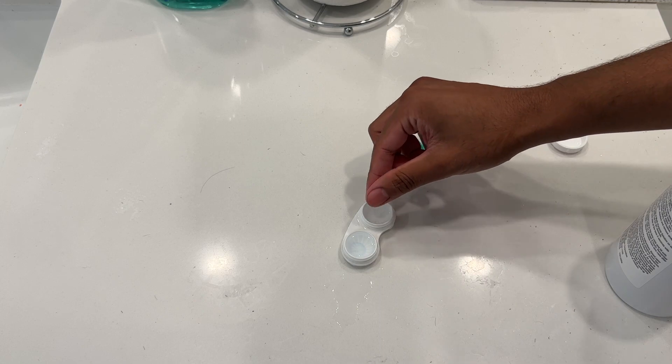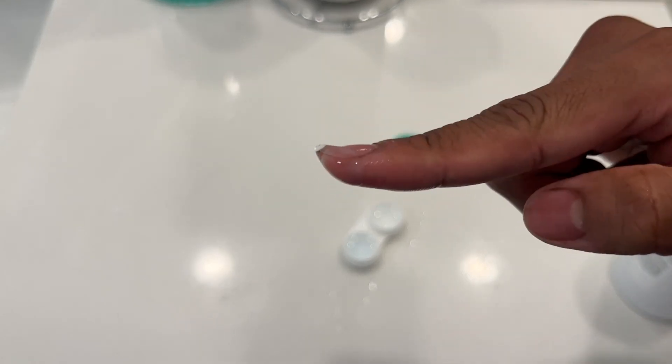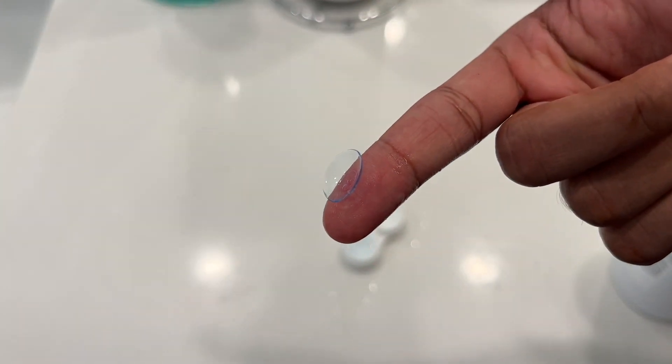Overall, I have been super satisfied. I've been using this for the past three years with all of my contacts. This one is able to disinfect — I don't have any eye irritation, and the contact lens becomes really smooth after putting this disinfectant on.